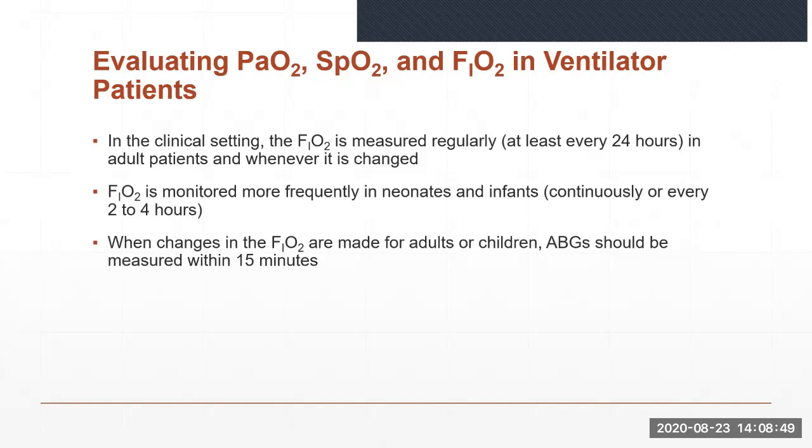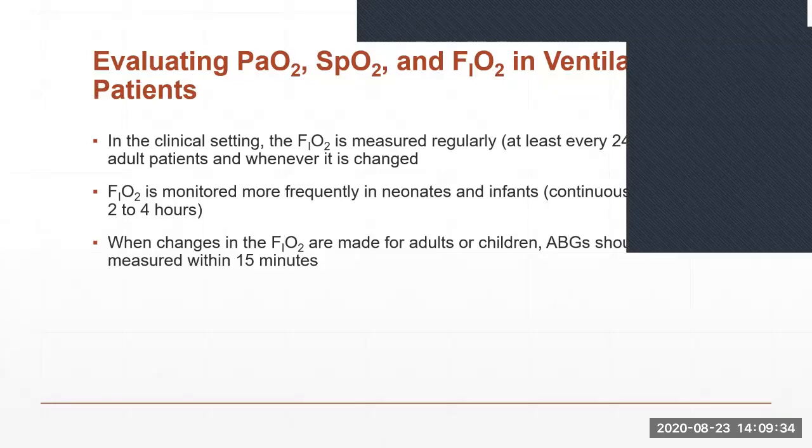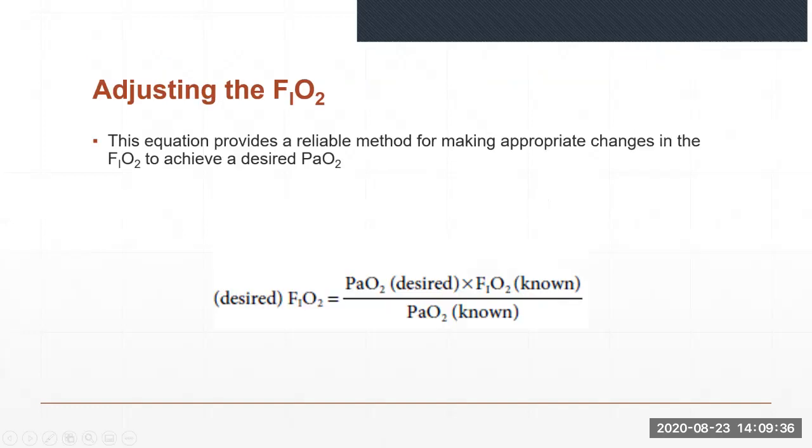Although the inspired oxygen percentage can be determined using multi-use oxygen analyzers, most ICU ventilators have built-in oxygen analyzers that can provide continuous measurement of FiO2. The ABGs obtained after mechanical ventilation is initiated are compared with the FiO2 being delivered.